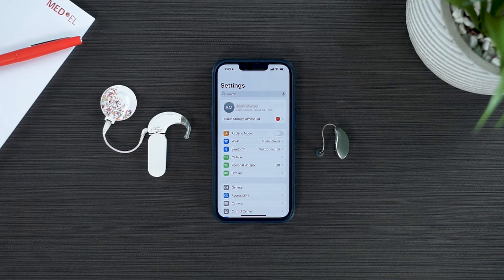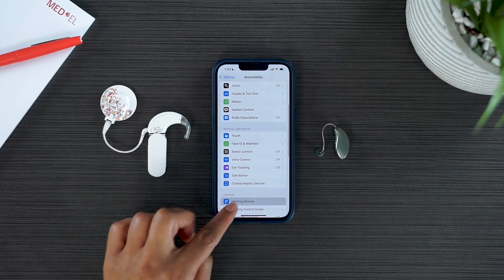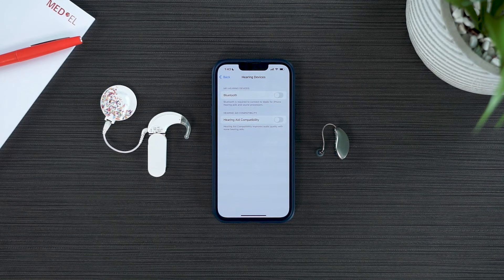Open the Settings app and select Accessibility, and then select Hearing Devices. You will need to make sure that both your audio processor and hearing aid are turned off, and the My Starkey app is uninstalled from your device before connecting.